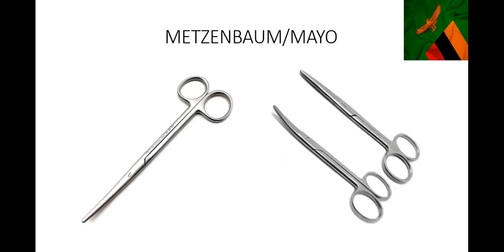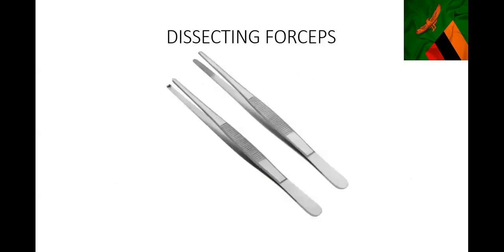These are scissors - Mayo and Metzenbaum scissors. The one on the left is really a dissecting scissors when you want to dissect somewhere, and the ones on the right you'd use maybe to cut something. These are dissecting forceps - we all know them for holding onto tissue as we are suturing or dissecting.